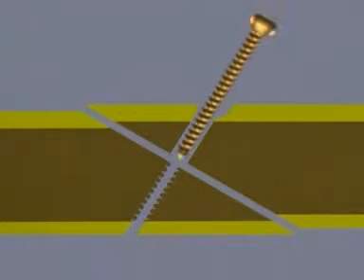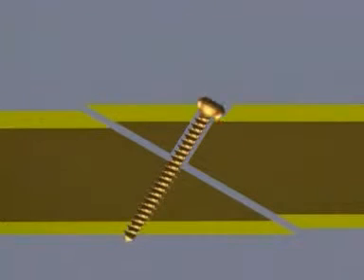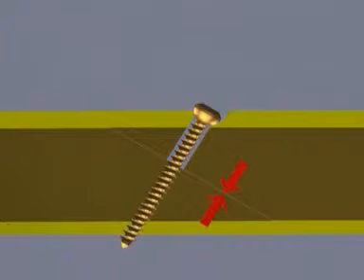The computer animation further illustrates the mechanism. Note the gliding hole in the proximal cortex. The screw head comes into contact with the bone. And with further tightening, the fracture gap closes.